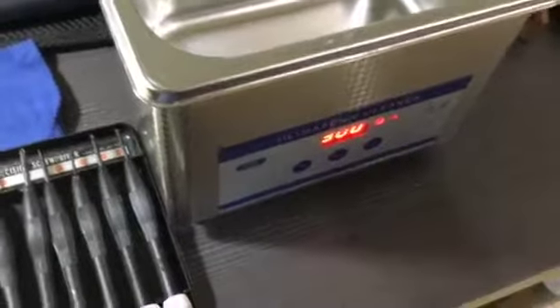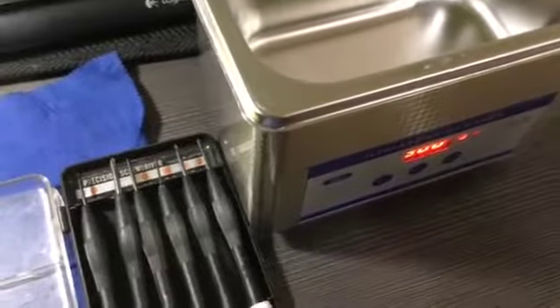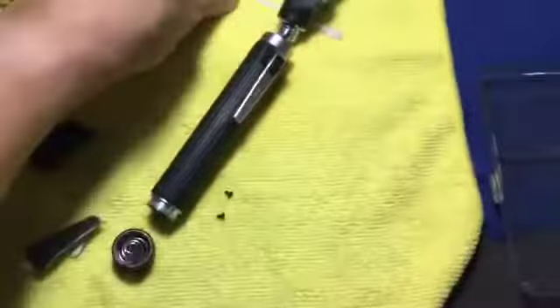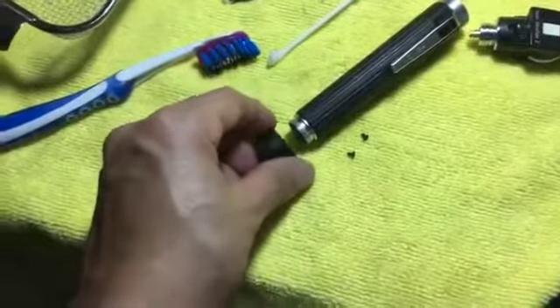It would be great if you have an ultrasonic cleaner. You use some distilled water and a little soap to clean it. You also need a small set of screwdrivers, some rags, and some Q-tips.